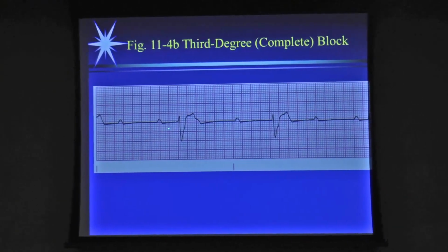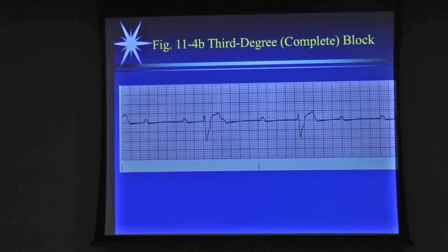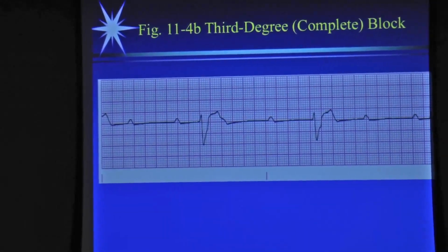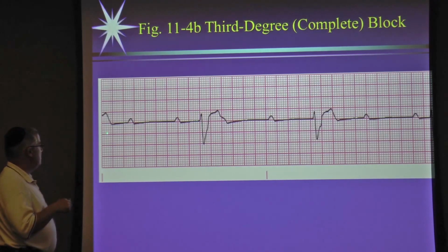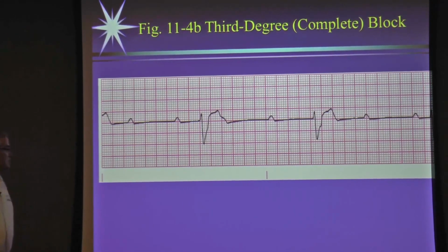So what do we have? We have more P waves than we have QRSs, no constant P-to-R intervals with a wide QRS, and a much slower heart rate. Okay, much slower. So this is the more typical third-degree heart block, the more unstable patient. Again, if we mapped out the P to Ps, they actually probably are falling pretty regularly. Like we probably have one hidden here, another one hidden here. So the P waves are probably falling pretty regularly, and the QRSs are also going to be falling pretty regularly.